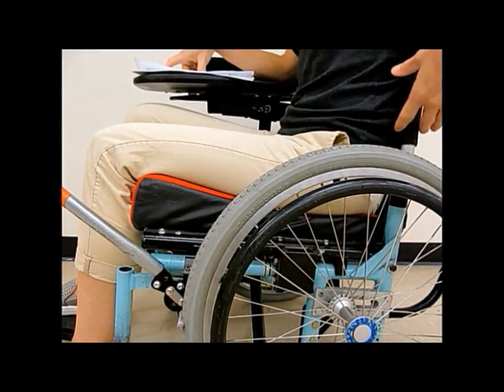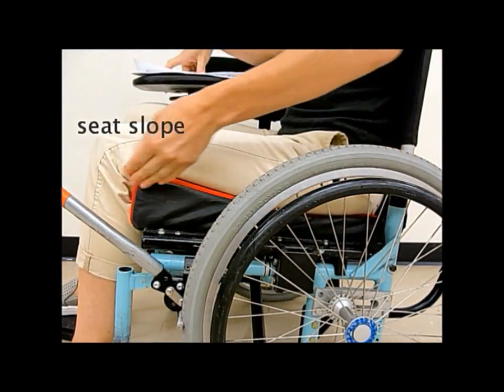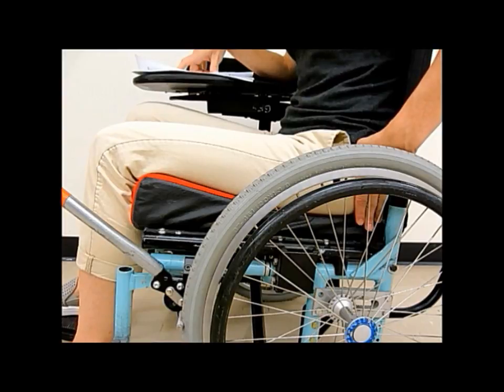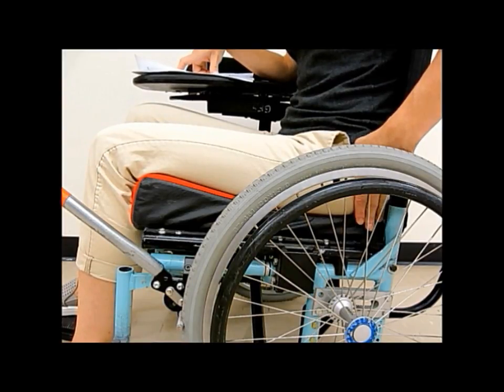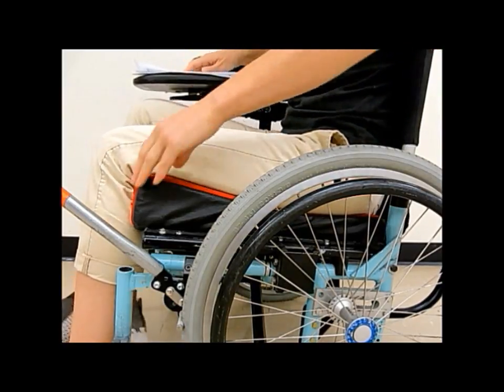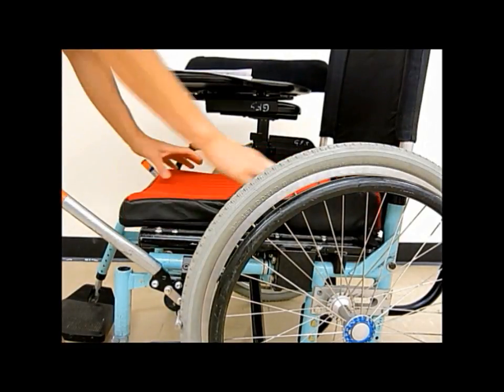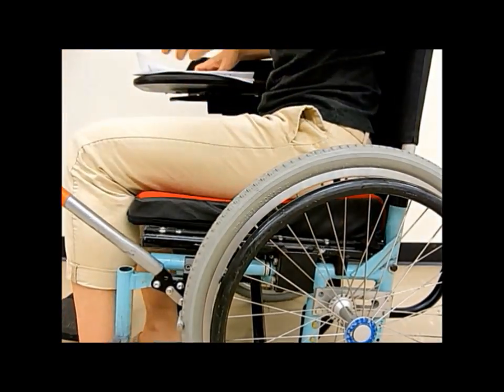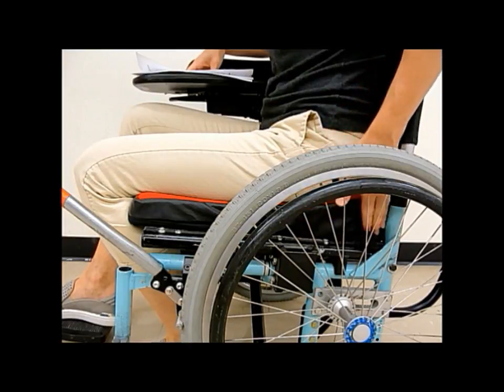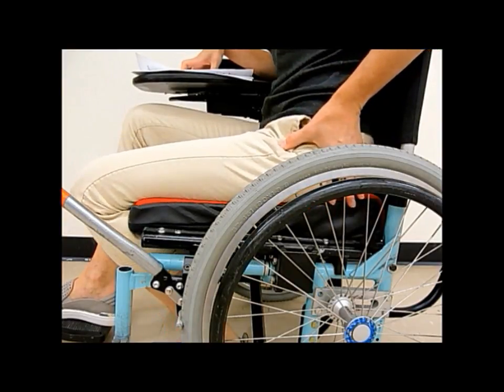So if your client tends to lean on their backrest when wheeling, a small amount of dump will help keep their pelvis near the back of the seat. So you can see that there's a tapered wedge here. Conversely, if the client sits up while wheeling, a slight anterior dump will help to encourage a neutral pelvis. And also an anterior dump opens up the hip angle, making propulsion easier for people with tight hamstrings. So I'll just change this around. This is for the visual, but you would potentially be changing the angles on the actual seat, not the cushion, to achieve the anterior or posterior dump.